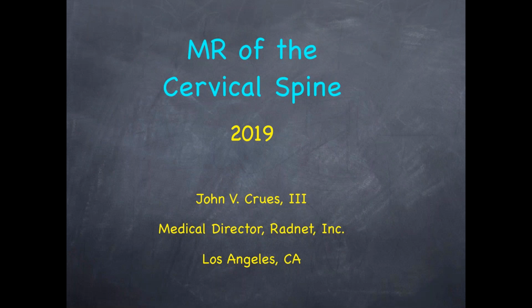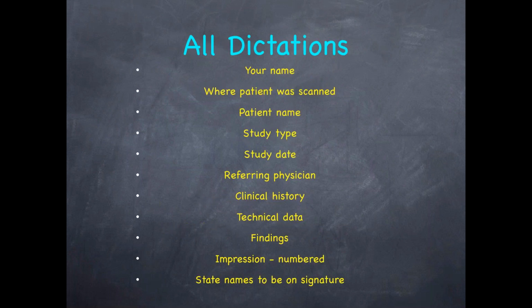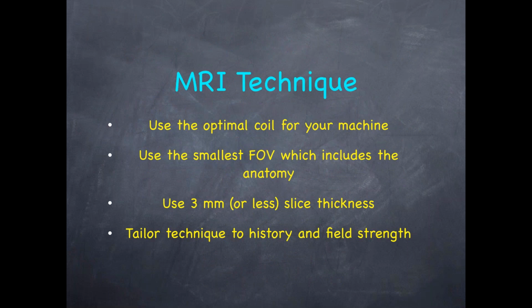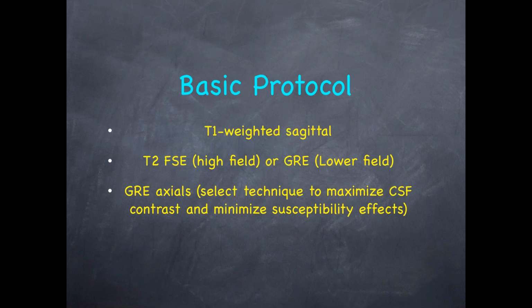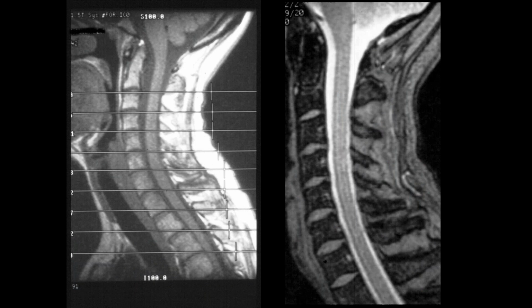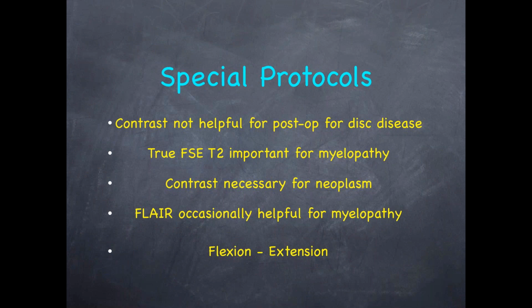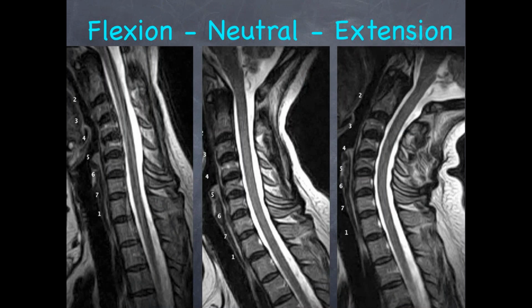So we'll start talking a little bit about cervical spine today. Forget this stuff. Okay. So the protocol stuff here is all outdated, so let's forget this stuff.